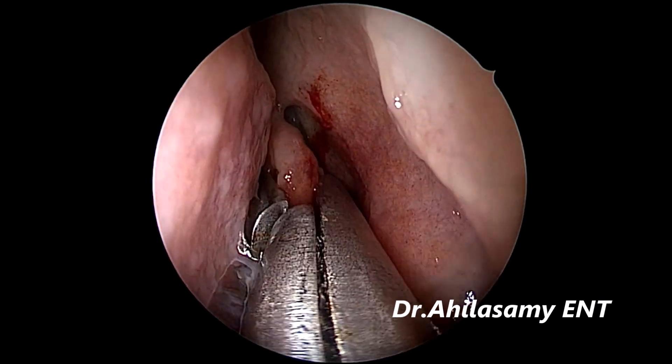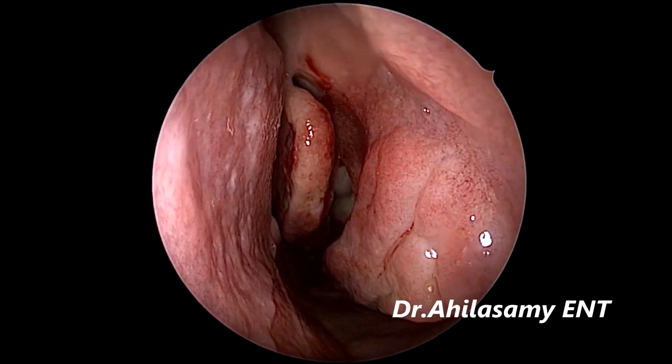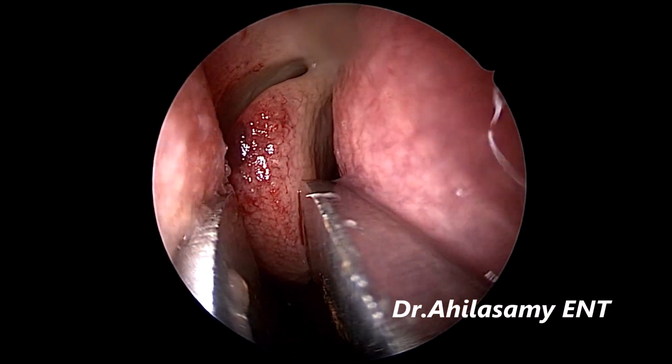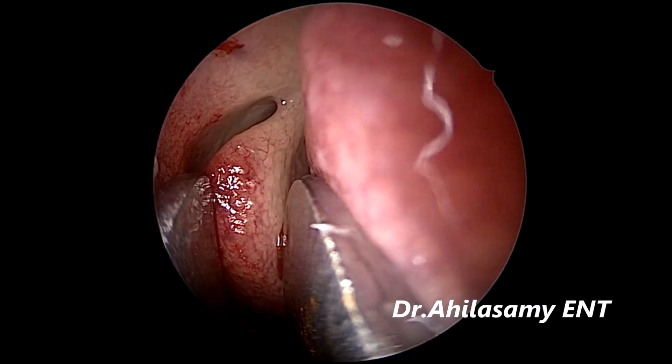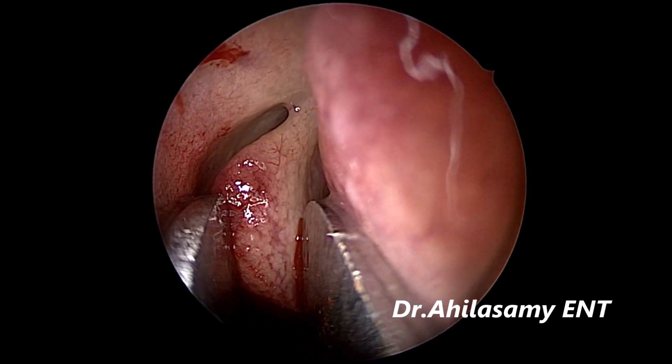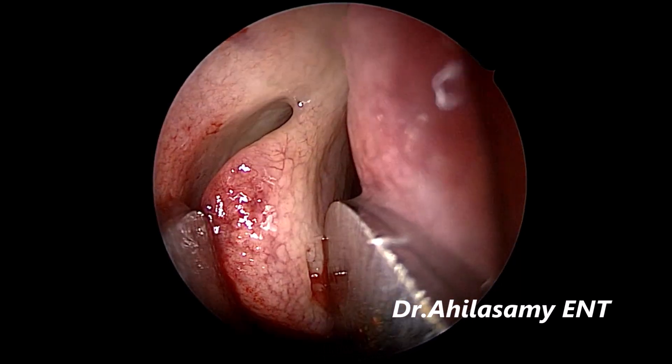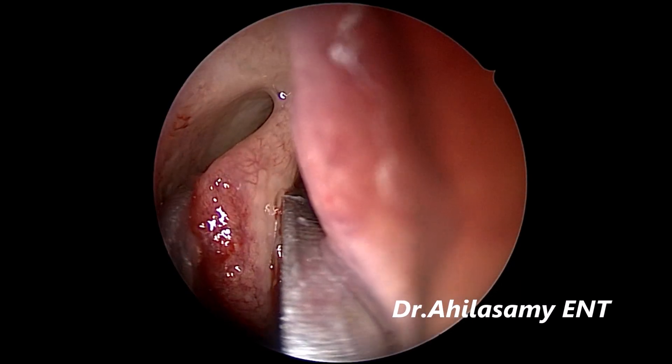They have 8 mm, 10 mm and 12 mm sizes. See now how beautiful the concha has been reduced on the left side. Now I am going for the concha crushing on the right side. It is quite a bigger concha. Gently insinuating the concha crusher to crush it.